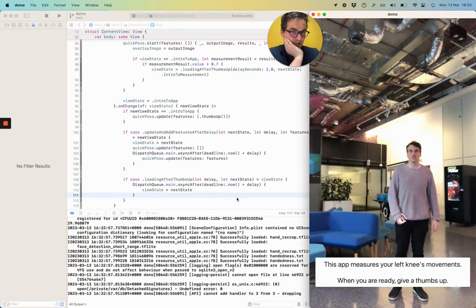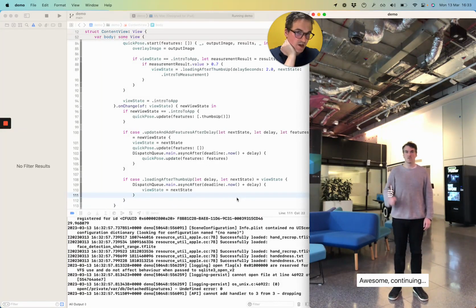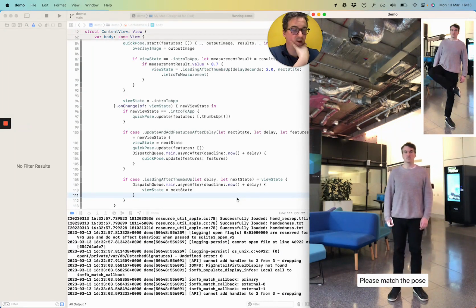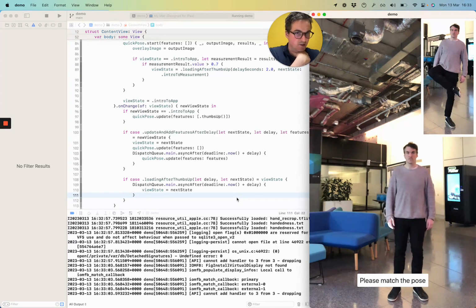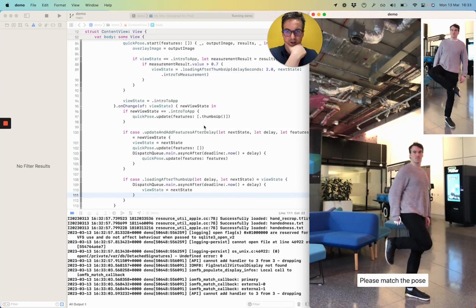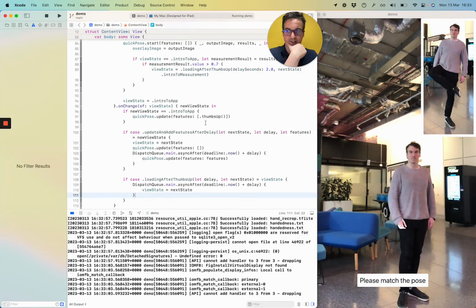So we're getting thumbs up from the detector from the start. Awesome, continuing. Please match the pose. Now I think that's a pretty good user flow. I kind of note though that we've lost the change in features. So it's just showing me the thumbs up all the time. Let's tweak that.